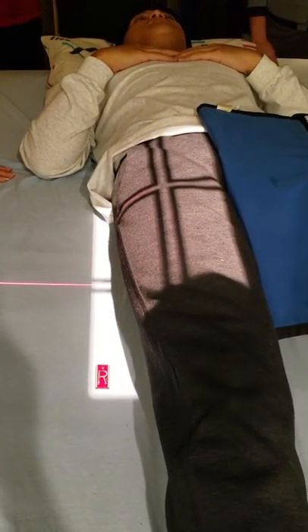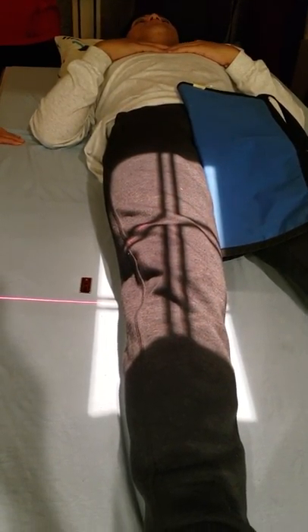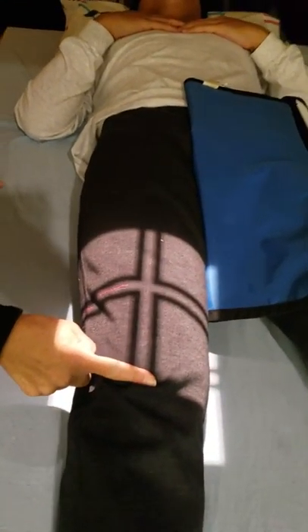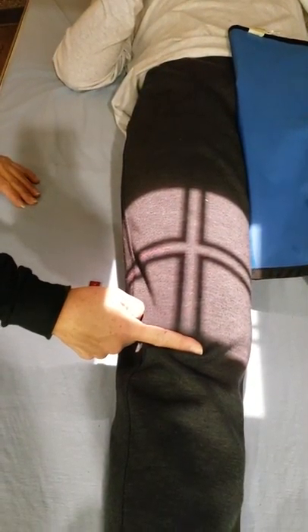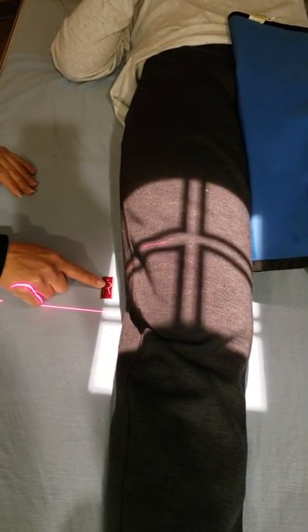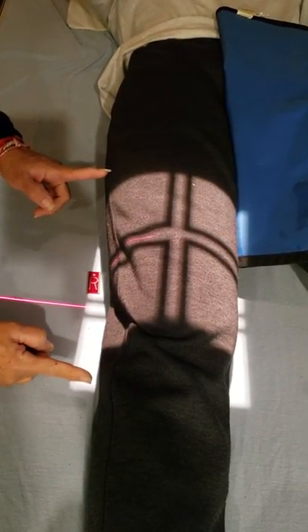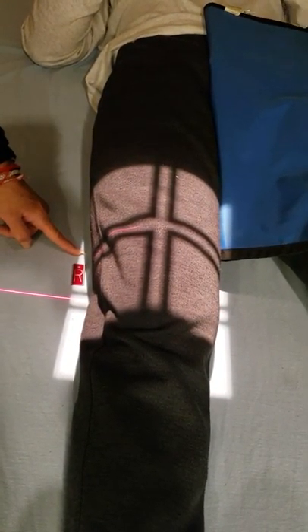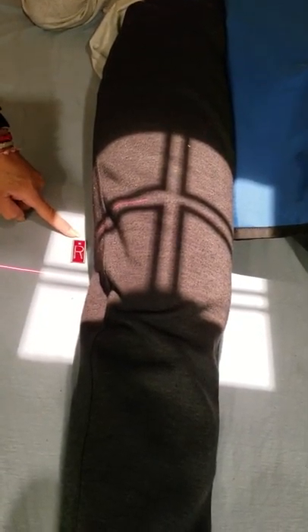Then I'm going to go ahead and expose that, and move down to include past the knee. I need to collimate and include the other joint — the knee joint — going over to the patella to make sure I have the joint. Notice how right here shows where I end my film — my collimation is a lot smaller because I'm going from here to here. Notice that I'm overlapping my film at my marker. I'm using that as a guideline to make sure I include the overlapping area so I don't miss anything.